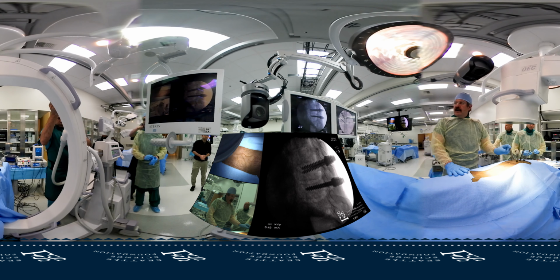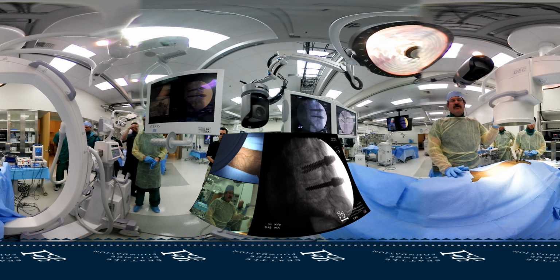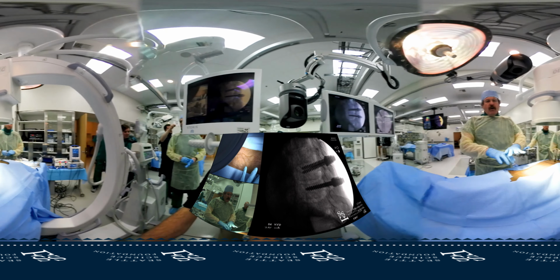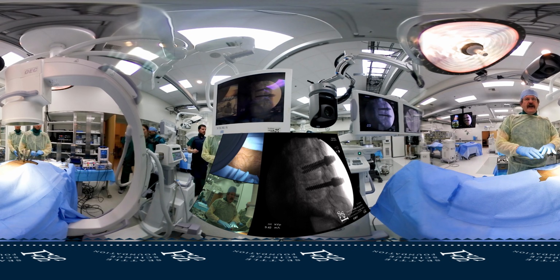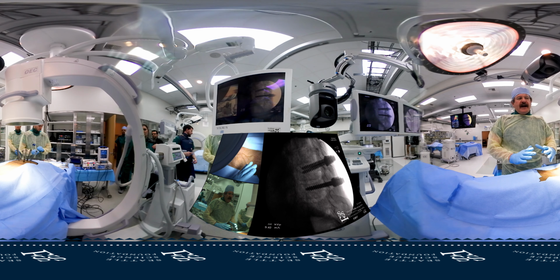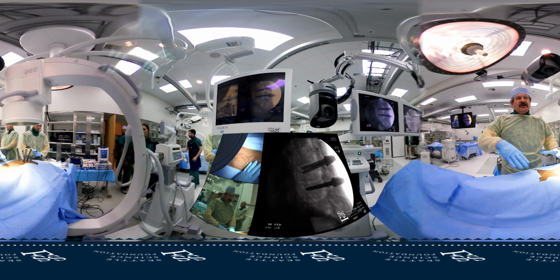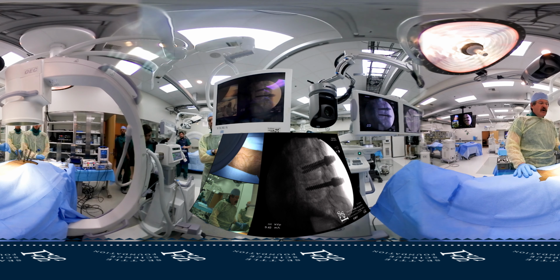To me, the ideal situation. So usually my construct for that's going to be at least 4 screws above, 4 below, and I don't need to put them right next to the fracture. I can spread them out a little bit. And the nice thing about ankylosing spondylitis is we can spread them out as much as we want. We can use 6 screws above, 6 below.